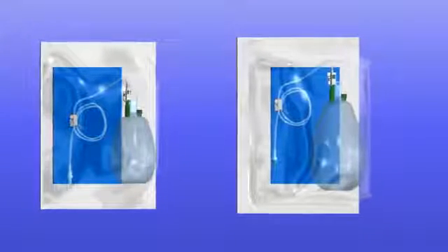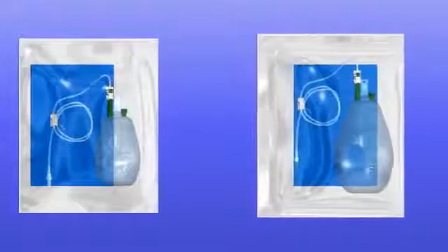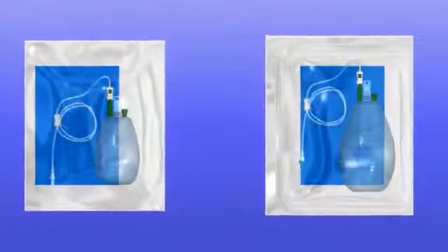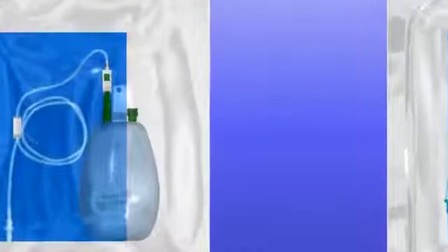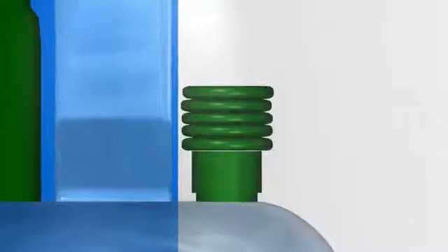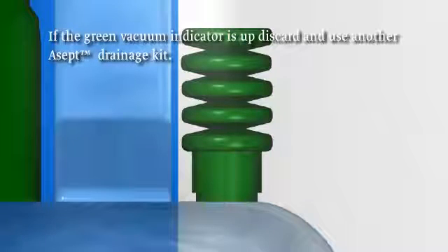Use of the ASEPT Drainage Kit should be easy since you have been fully trained. Follow these step-by-step directions. You should drain fluid every 1 or 2 days or as directed by your doctor. Pick up the bag that contains the ASEPT Drainage Kit. Look at the green vacuum indicator on the top of the bottle. This indicator tells you if there is a vacuum in the bottle. The indicator should be down. During the drainage procedure, the vacuum indicator will expand upwards as the vacuum is depleted. If the green vacuum indicator is up, discard and use another ASEPT Drainage Kit.